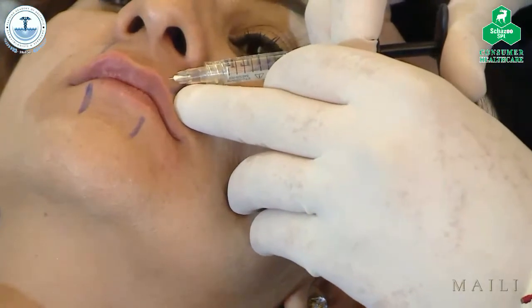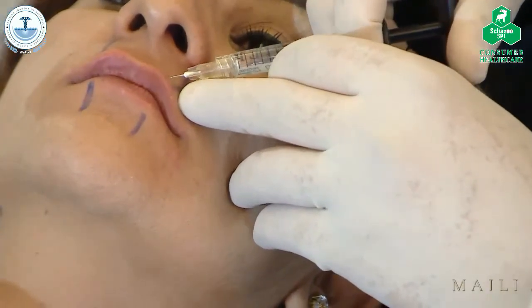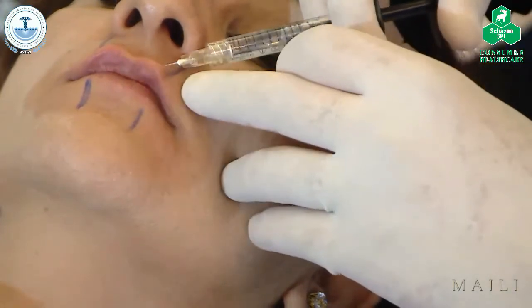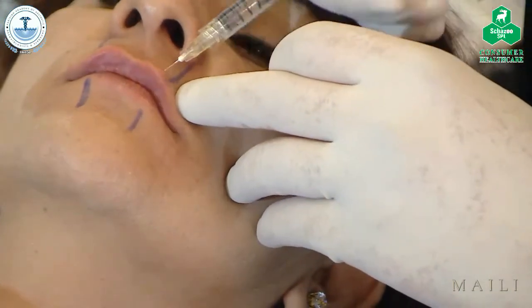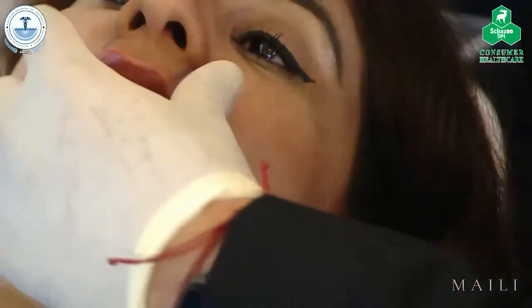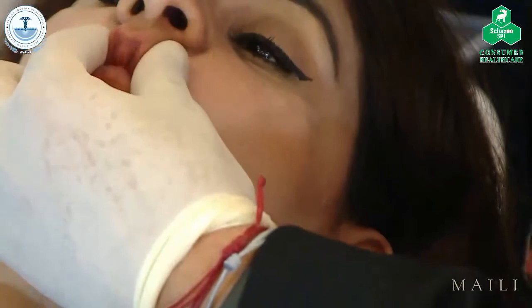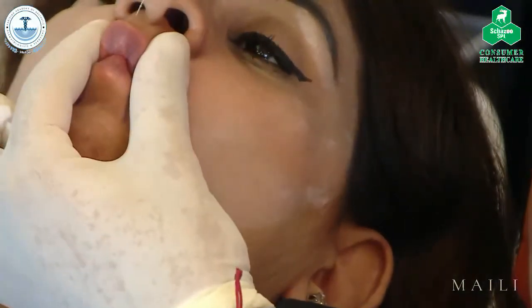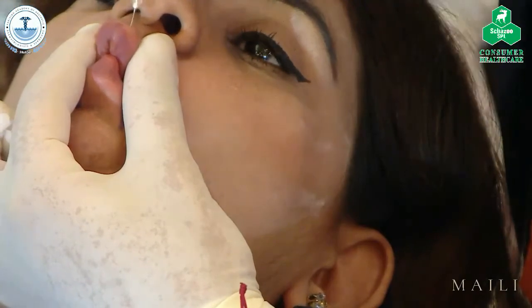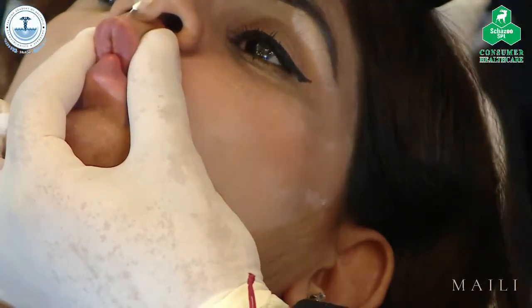And remember when to stop pushing your finger on the plunger. It's where the tip meets the vermilion border level. We don't give more than that. And then I'm going to give on the side as well. Then I'm going to do the exact same thing I did in the middle. I'm going to hold the lips up. I'm going to go 1, 2, 3.